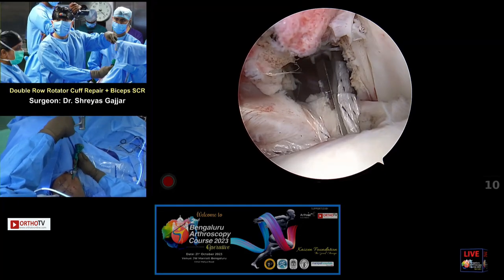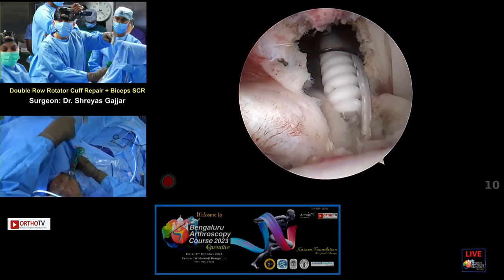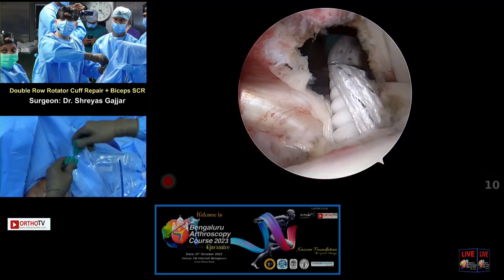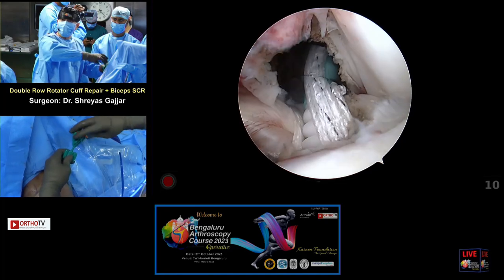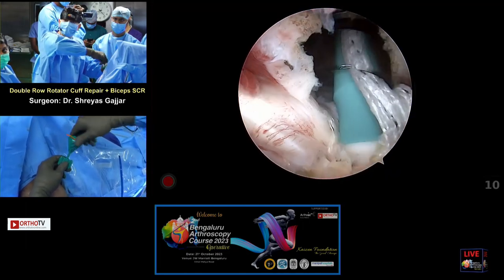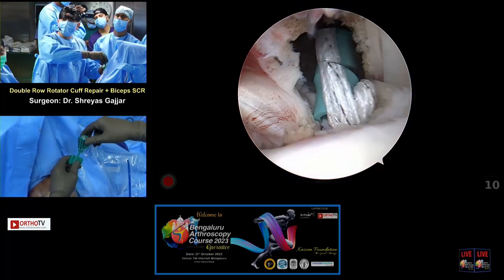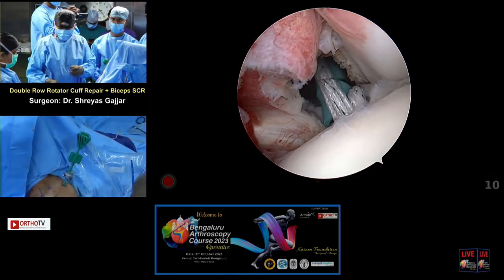For those who don't know, with the SwiveLock anchor you have to tap it till the screw tip reaches the bone, the laser mark, as you can see here. Then you rotate it clockwise, holding the thumb pad. If you have the outside image, you will get that information. Yeah, we are able to see both, sir. And the sleeve of the anchor decides the depth. So we have reached that, and then you can do the counterclockwise movement of the thumb pad to ensure that your anchor is flush. You don't want to go too deep because you want purchase in the cortical bone. So it's flush. I'm now going to remove the inserter handle.